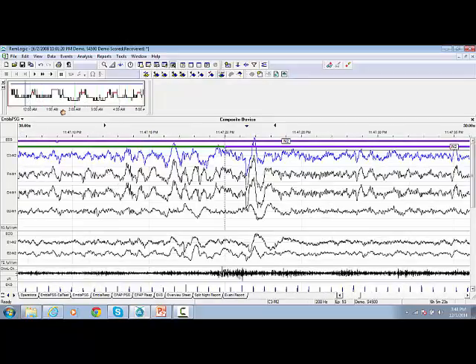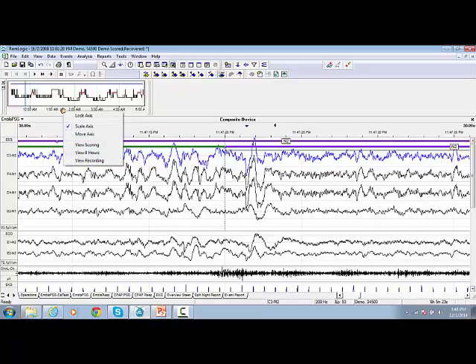If you right-click on the x-axis, then you will have the possibility to lock the axis, and this is in order to prevent it from being moved or scaled.